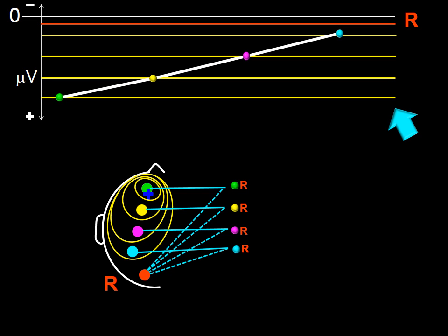Now, I am introducing the corresponding voltage graph.